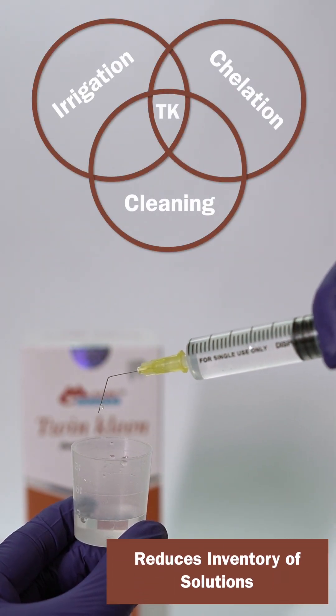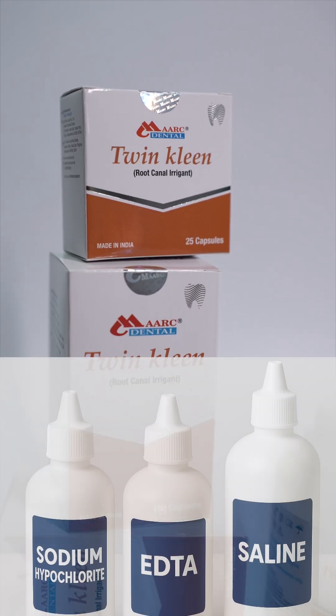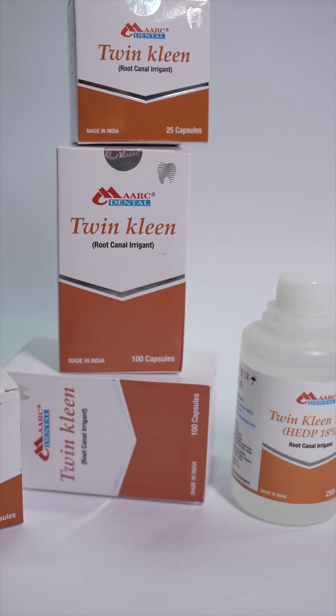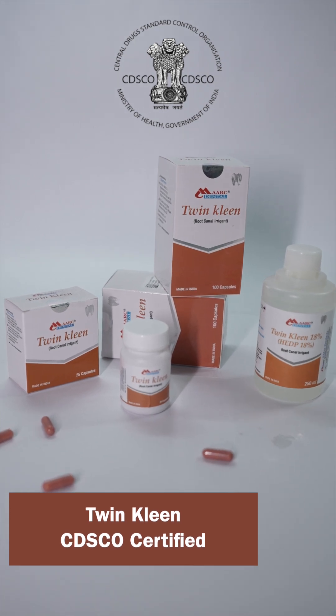Simplify irrigation. Chelation and cleaning combined into one solution, reducing the need for multiple bottles. TwinClean — simplifying root canal irrigation for predictable and efficient outcomes.